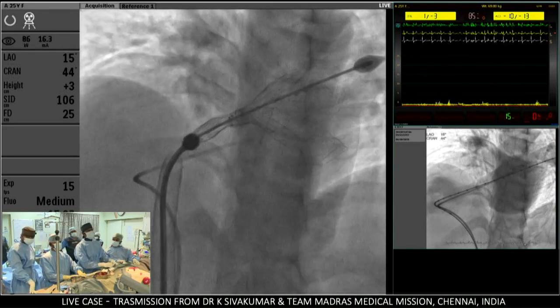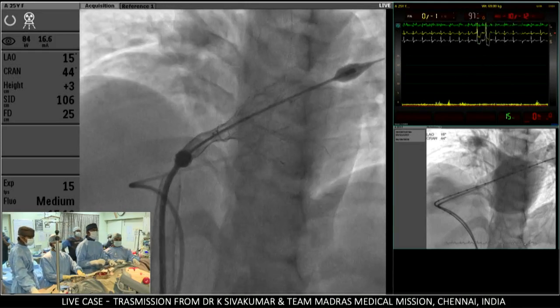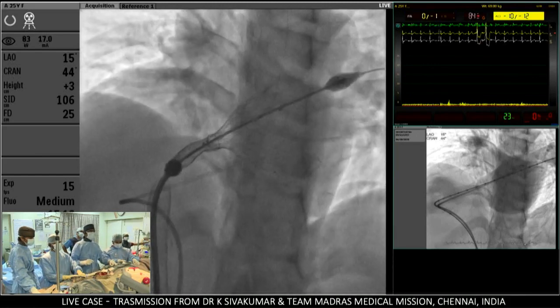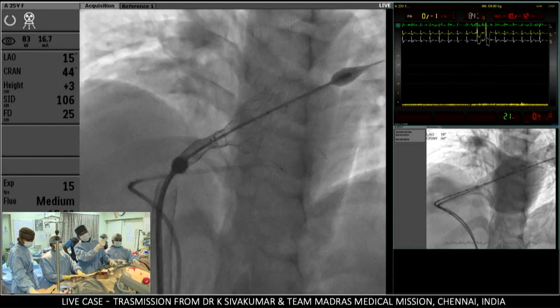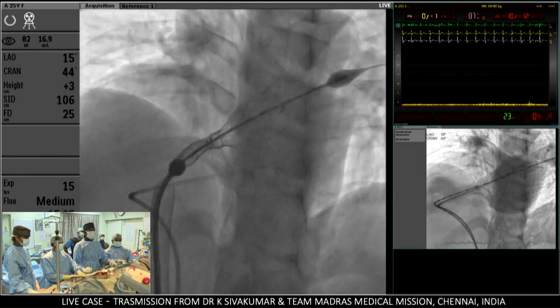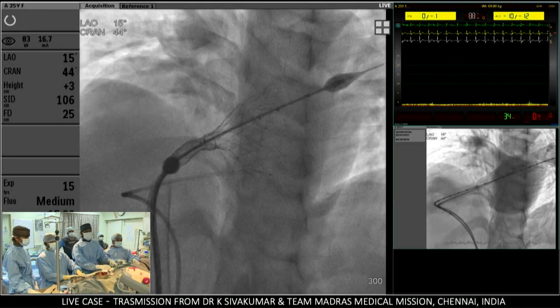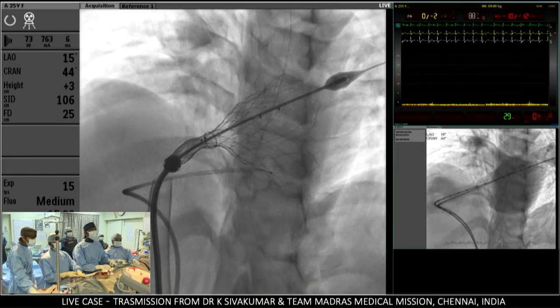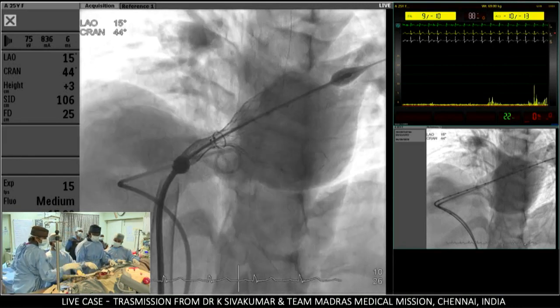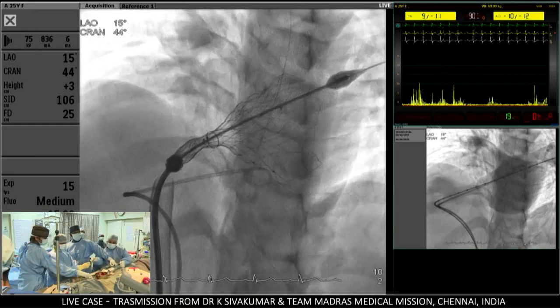Just a quick question. Whilst you're doing the angiograms, do you wait for the valve to warm up so it expands to its full size? Yeah, it's expanding, Salim. It's becoming larger. A couple of rotations, till you come to the platinum marker. That's enough, Shiva. I think we can come back more. Okay, let me make another angiogram. I think I'm happy here, Pramod. Varakan, Tejasvi, can you get the injection? Now, see the picture now.